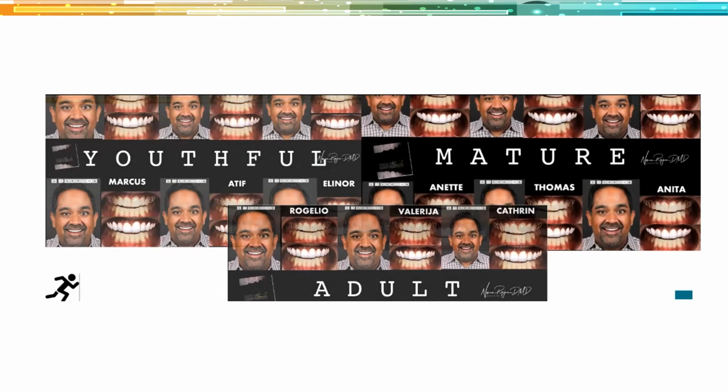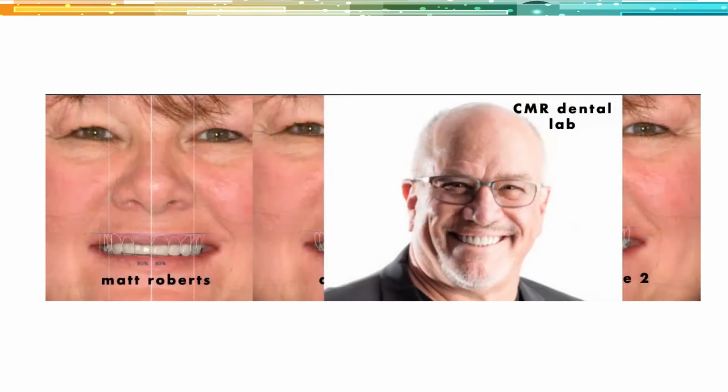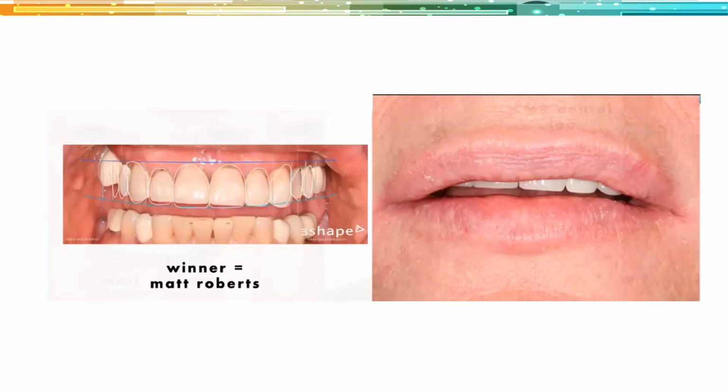And so when we did this process with Kathy, lo and behold, the one that she connected with was actually the Matt Roberts Library. That's Matt. He owns the CMR Dental Lab in Idaho. And what she said is that, yeah, I like those shapes of teeth, and that's what I think my teeth used to look like before I had these veneers. And that's step one. That's the connection with the patient, where you're getting into their mind and really figuring out what they want before you do something irreversible and they don't like it, right? So that's the whole point of this.